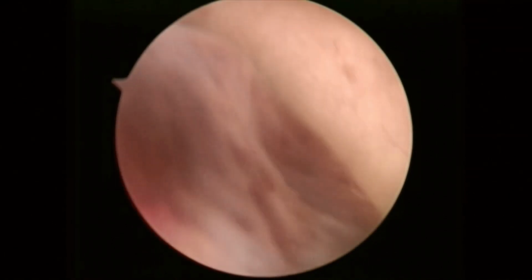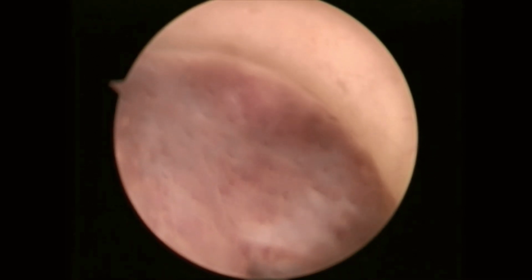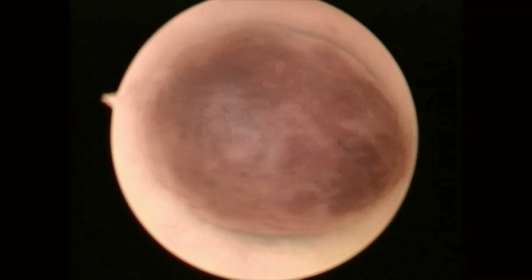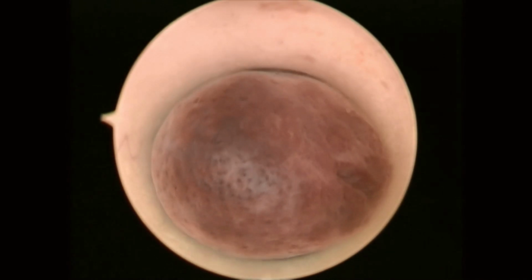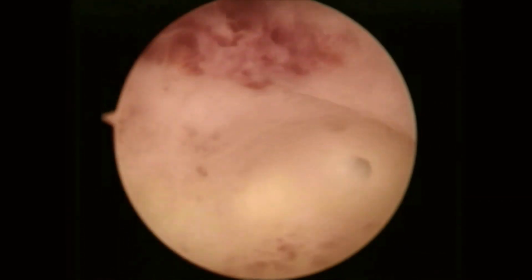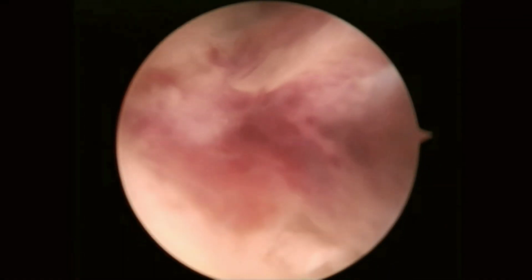Now this is another case of a large polyp which is occupying the lower portion of the uterus. Here it is, just beneath, beside, I would say, cranially to the internal os, you can see a large polyp occupying the whole cavity. But as you advance your hysteroscope, you can just enter into the cavity and you can see both the ostia and upper segment of the uterus. The upper portion of the uterus is vacant.